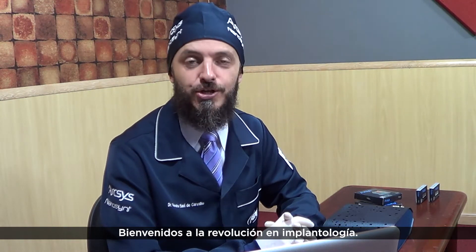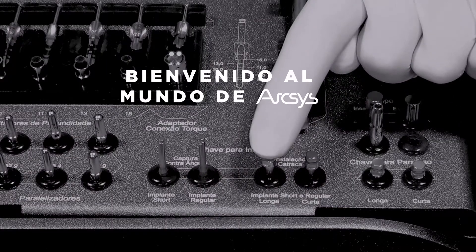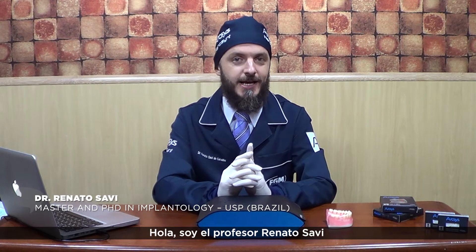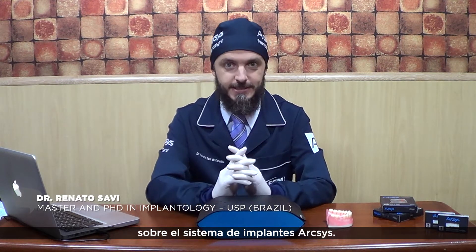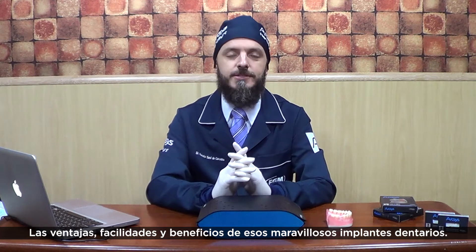Welcome to the revolution in implantology. Welcome to the FGM Arcsys Implant System. Hello, I'm Professor Renato Savi and I would like to share with you a little bit about the Arcsys Implant System — the advantages, facilities and benefits of this awesome dental implant.